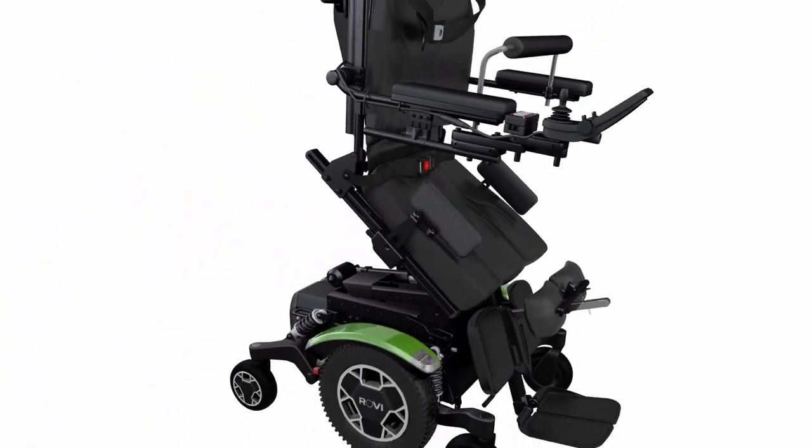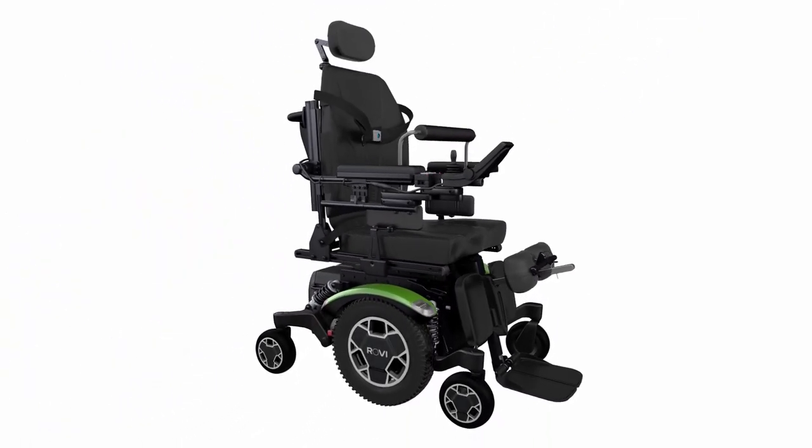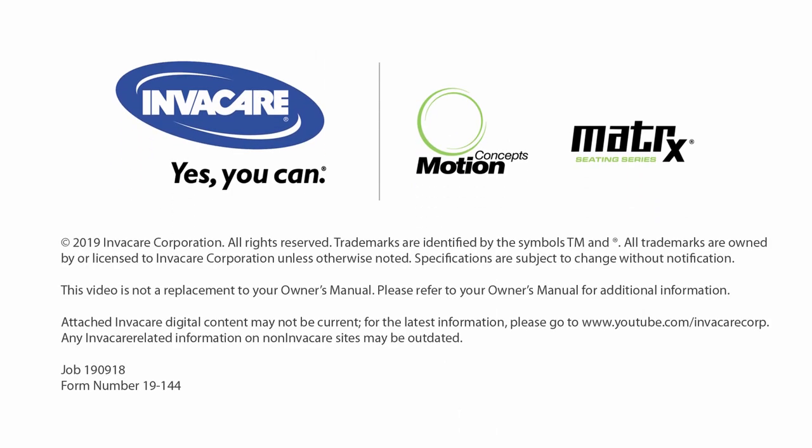Motion Concepts MPS Max — Stand for something better.